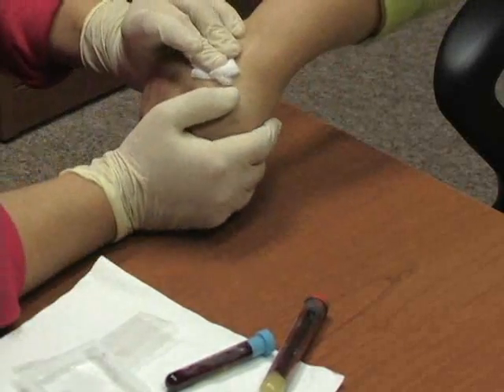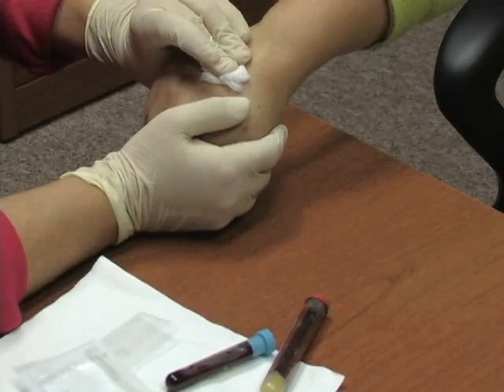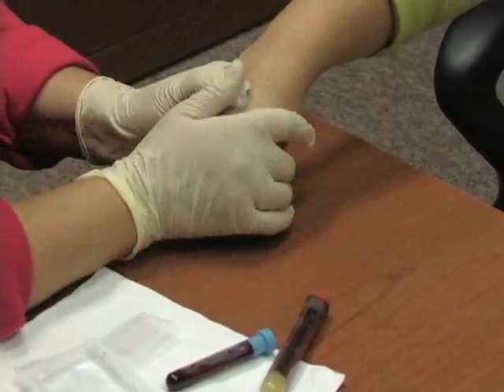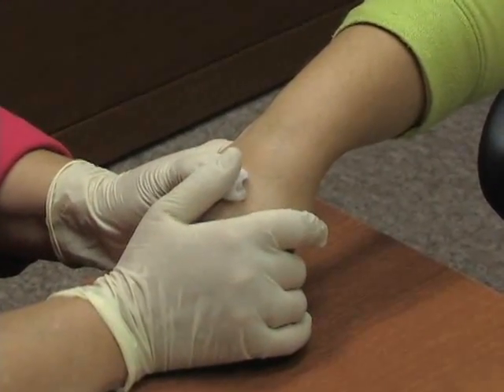Once this is done and bleeding has stopped, we can apply a bandage and we're all set. That's how you draw blood peripherally with a butterfly.